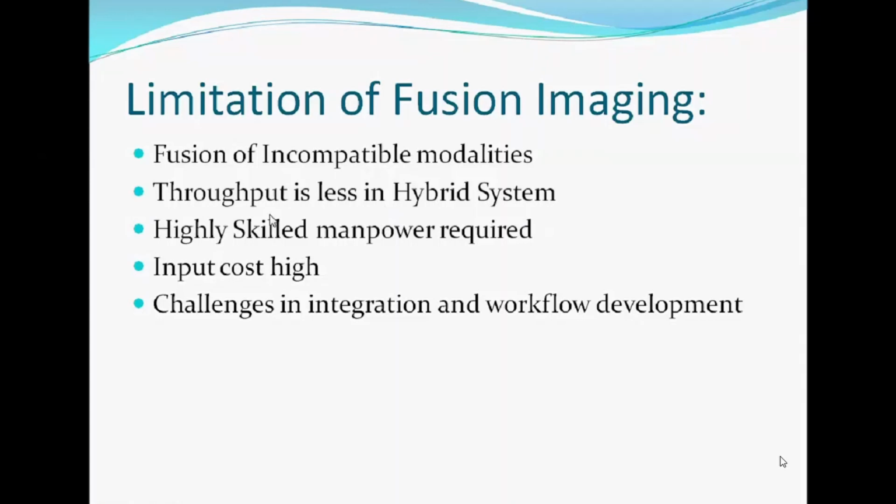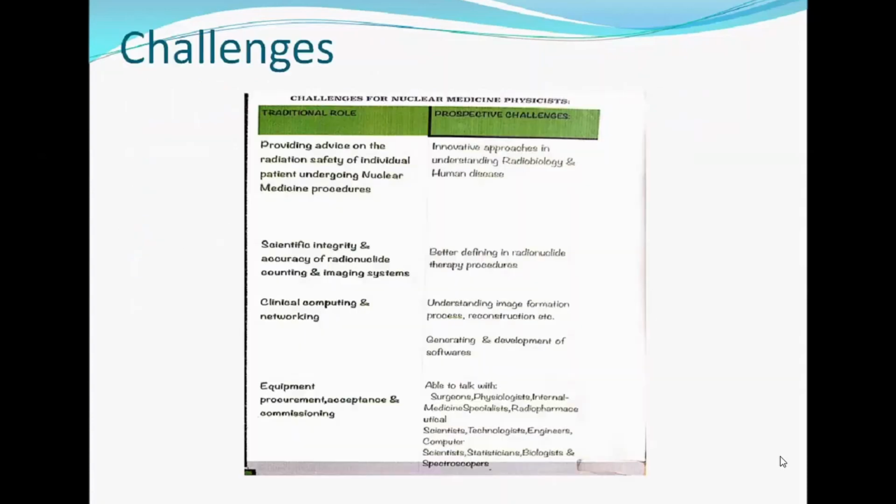If we want to grow further, you gain highly skillful knowledge and will be satisfied with your higher remuneration and position. Also, input cost is high. Installing a PET CT requires about twice the price of a CT system. Integration and workflow are very challenging for PET CT. Application software is still not completely developed: in which type of disease, which workflow and which acquisition protocol should be used. These are challenges. Still, if you want to grow in nuclear medicine, you have to have a very innovative approach.